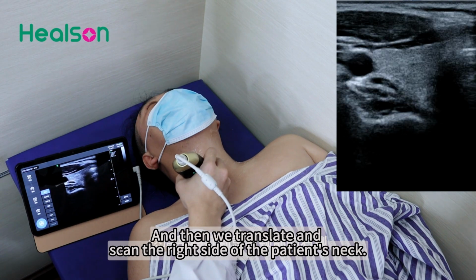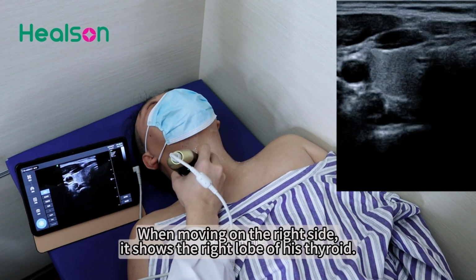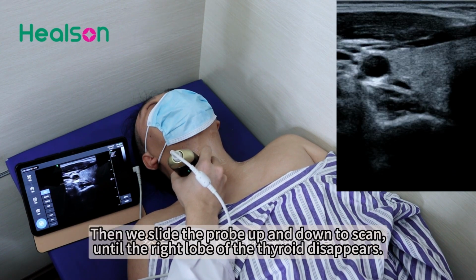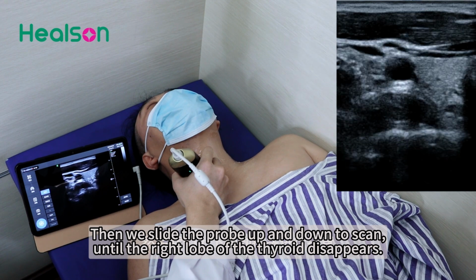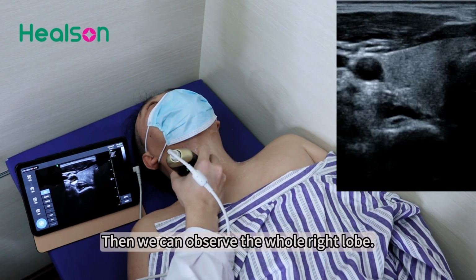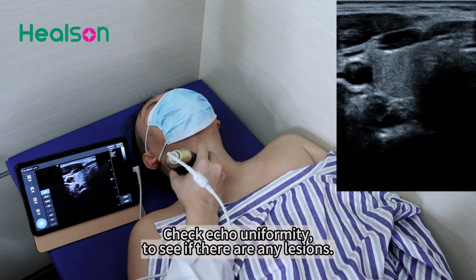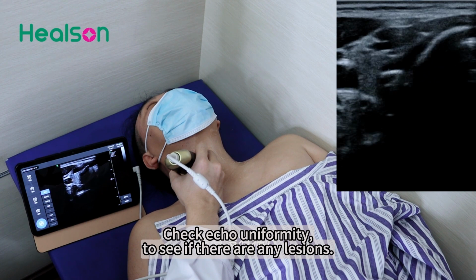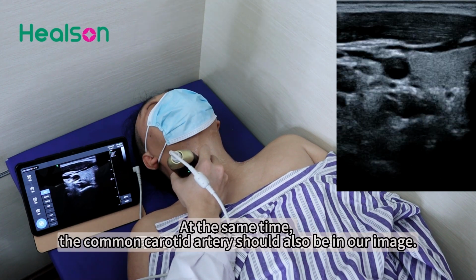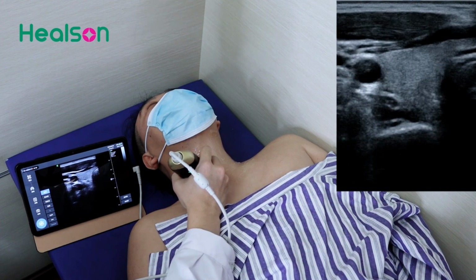And then we translate and scan the right side of the patient's neck. When moving on the right side, it shows the right lobe of his thyroid. Then we slide the probe up and down to scan until the right lobe of the thyroid disappears. Then we can observe the whole right lobe. Check echo uniformity to see if there are any lesions. At the same time, the common carotid artery should also be in our image.